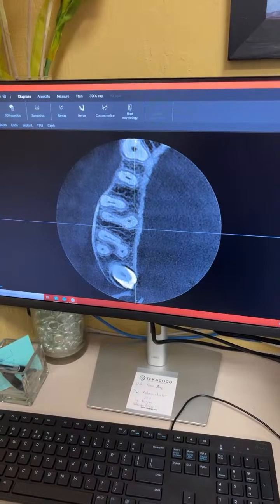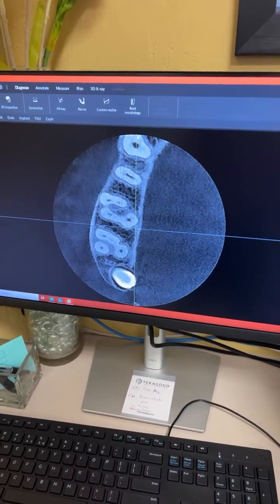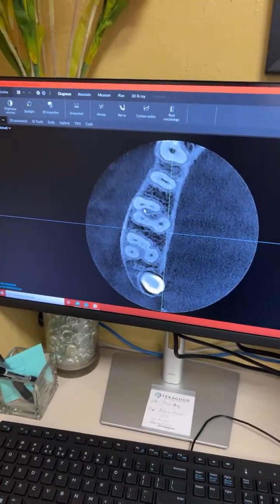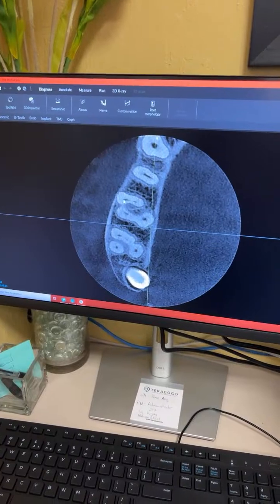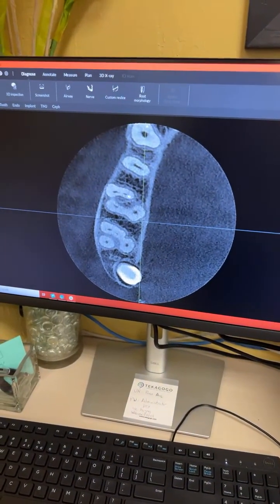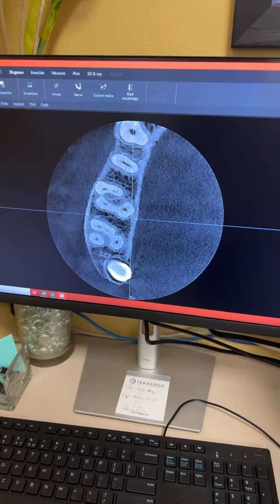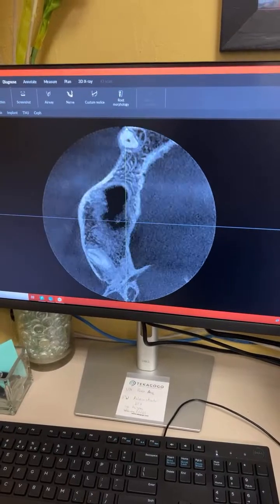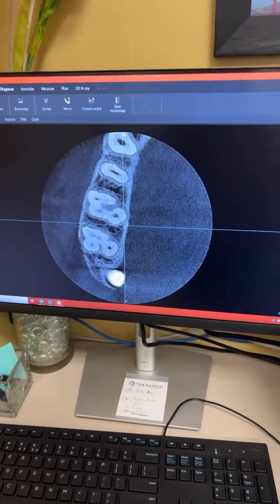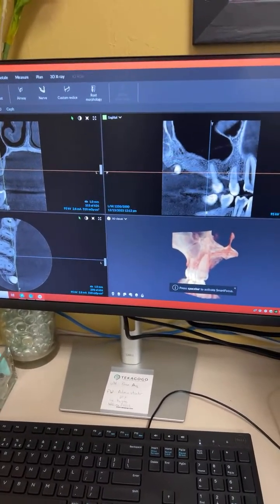It'd be nice to know that before you did endo. Yeah, look at that. So this is the, I don't know, this is meso here? Yeah, mesobuccal, mesolingual, and distal, and then palatal right here. Yeah, look at that. And then how do you get out of this thing? Just double click it. Double click? Oh, okay. And then you can do something with that.